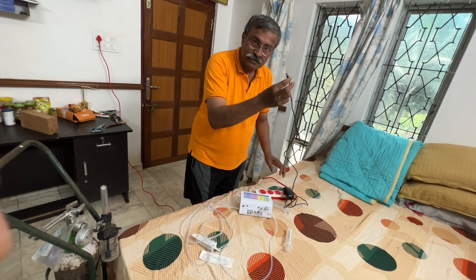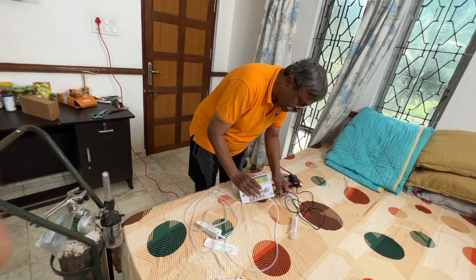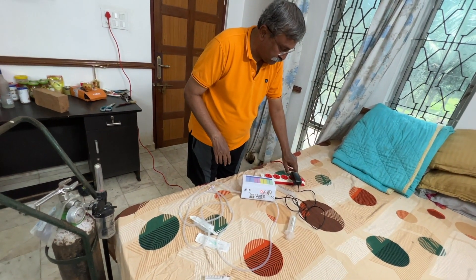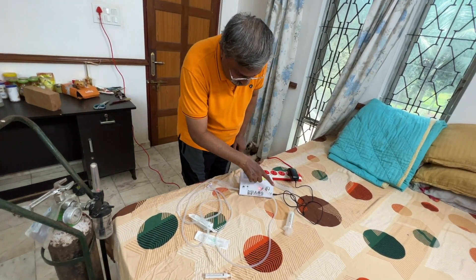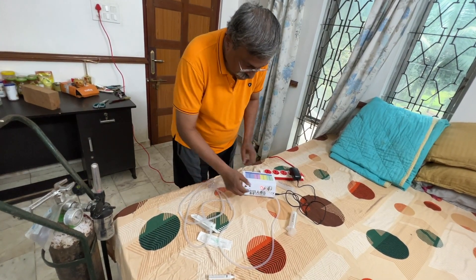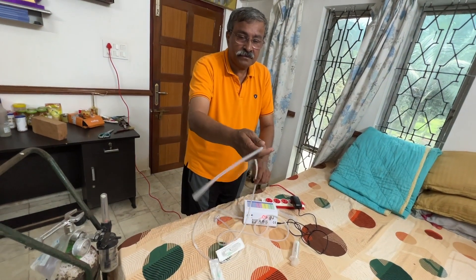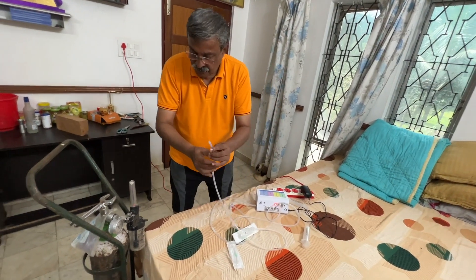These imported machines have got a CE marking. They have to be plugged into the main plug as shown here. We have an oxygen input wire and a silicon tube.